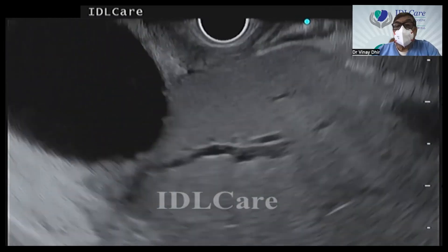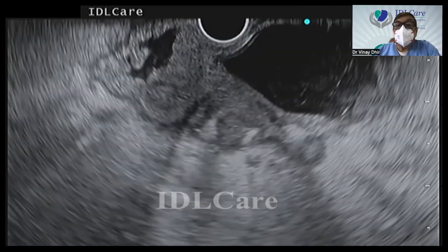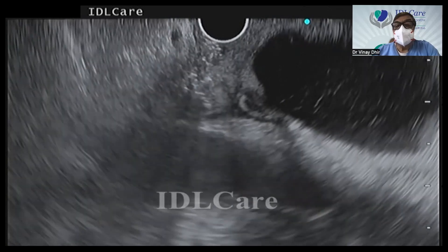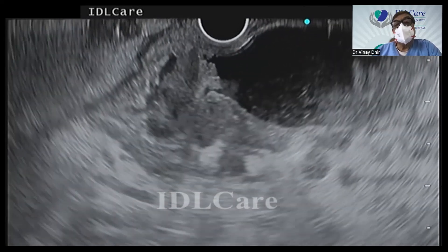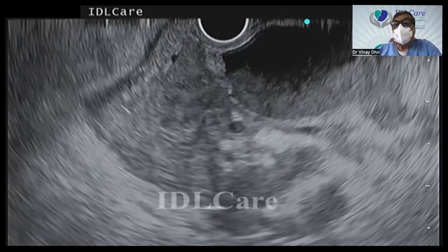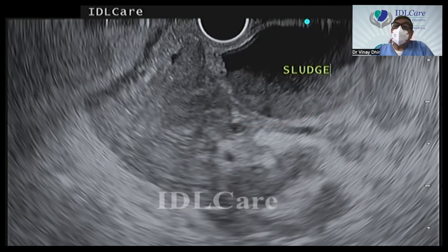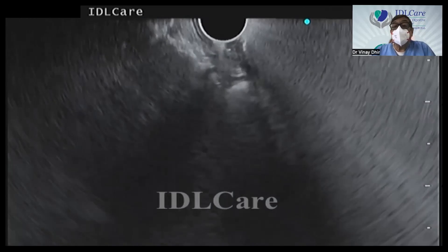So this lesion is here — almost 1.5 centimeters, it is growing inside. And you see a huge amount of sludge here. It may be difficult to differentiate sludge from tumor if a small sludge ball formation is present, then you may find it difficult.